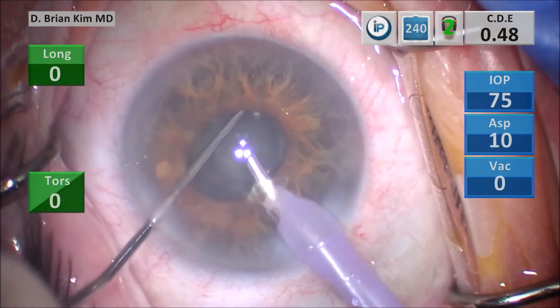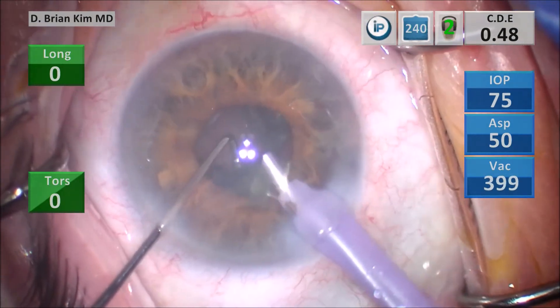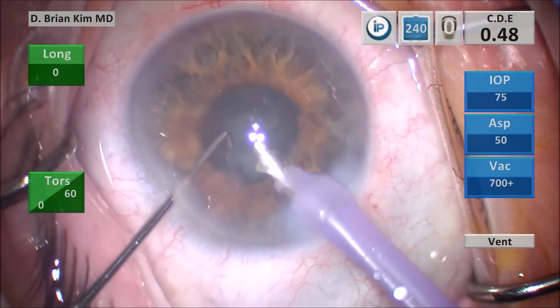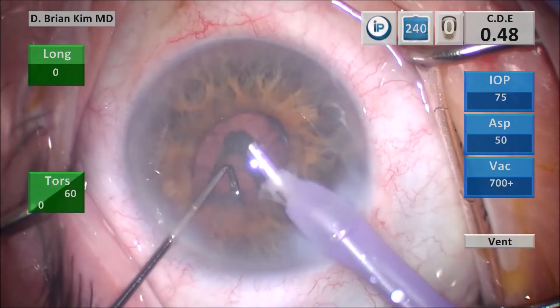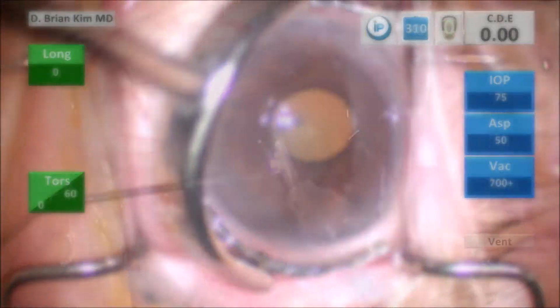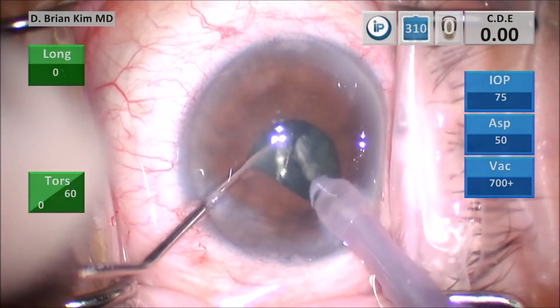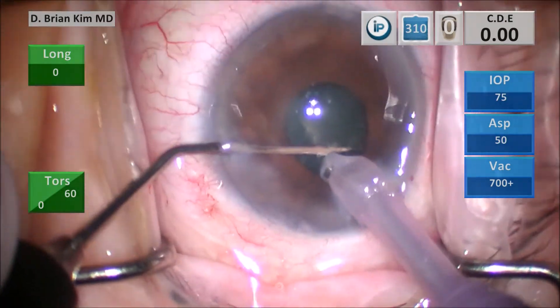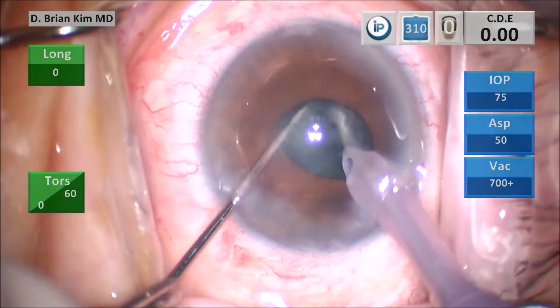This is a very, very controlled technique. I'm simply showing you a different way of doing cataract surgery that is essentially independent of the red reflex, independent of needing a large pupil, and very controlled. You place the chopper out to the equator, get under the lens, push down with the phaco tip, fracture the lens in half, take the chopper out to the contralateral equator, bring the chopper towards the middle, and it fractures the right hemi nucleus.